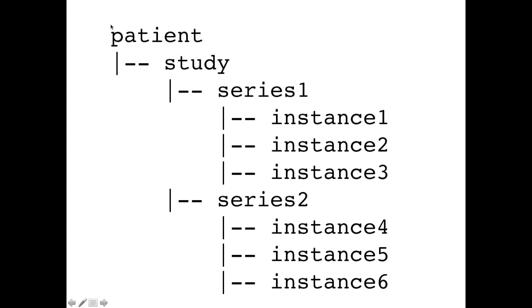And so this is the basic DICOM metadata structure. At the top level, you have a patient. Each patient then can have multiple studies. Each study is made up of multiple image series. And then finally, when you get down here, you have an individual image instance.